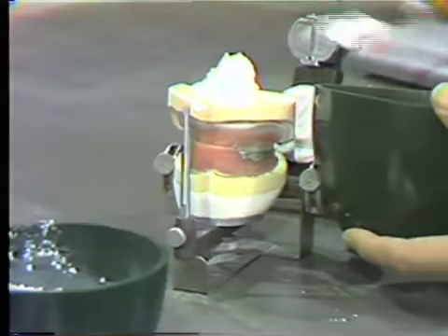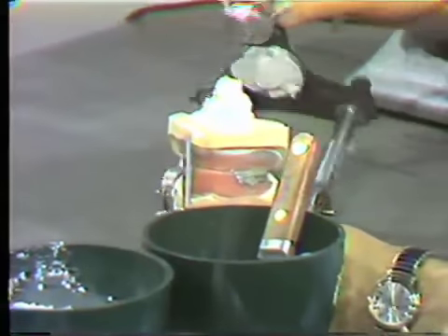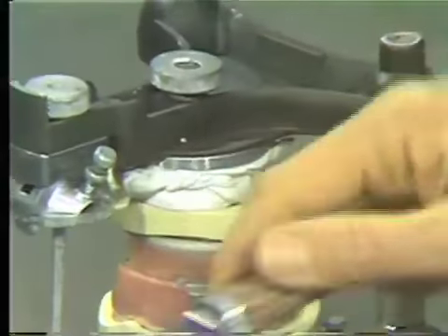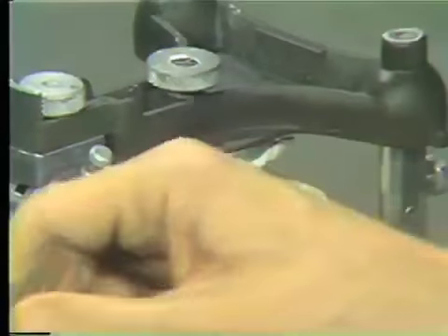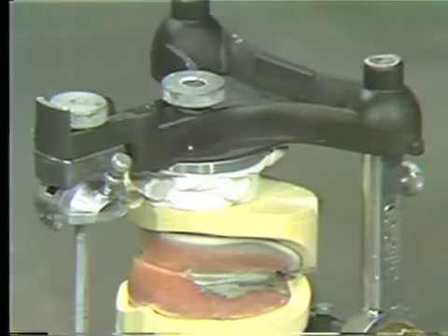A little more up here to ensure that we're going to contact, and we will close the articulator. Any excess that should happen to come off, as you can see in the front, we will remove. Now we will allow the articulator to stand in that position until the plaster has set.